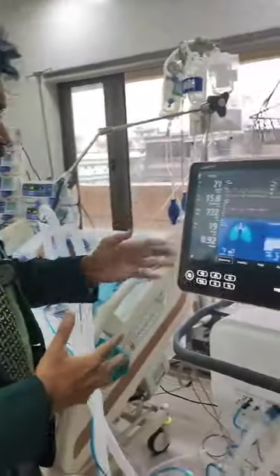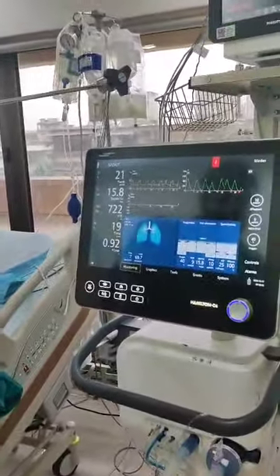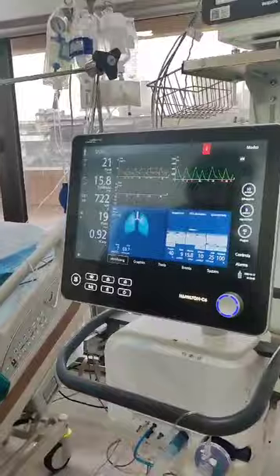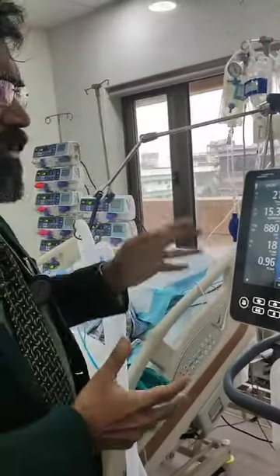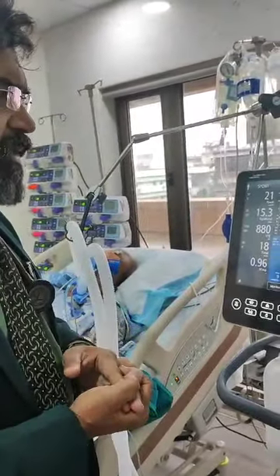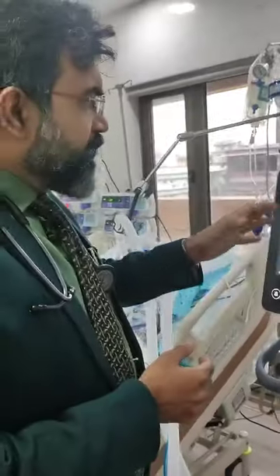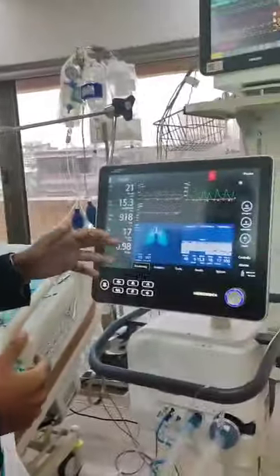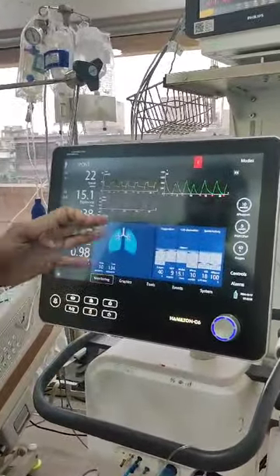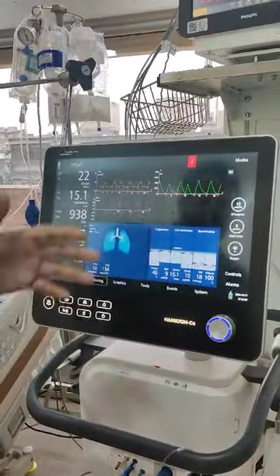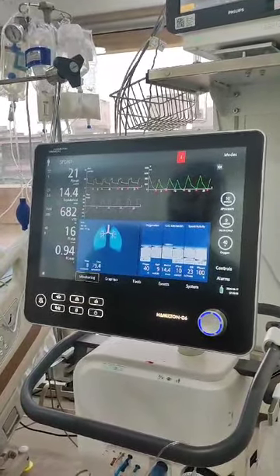We have a patient who we are trying to wean off the ventilator. He is in multisystem organ failure but now he is kind of improving. What I have done is regularly, as anyone would do, reduced the pressure support and put him on pressure support to do a spontaneous breathing trial.